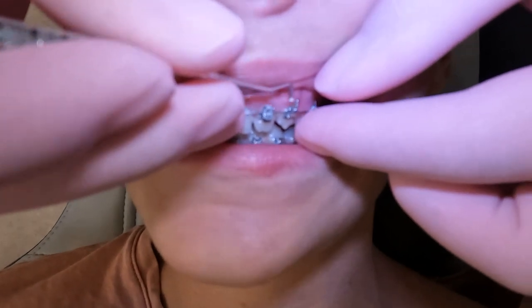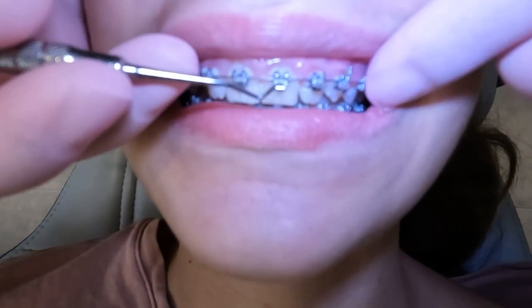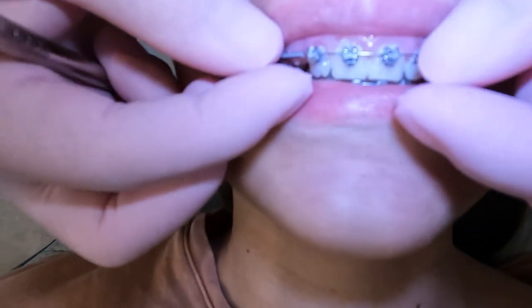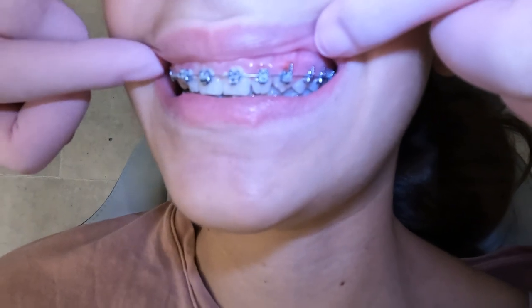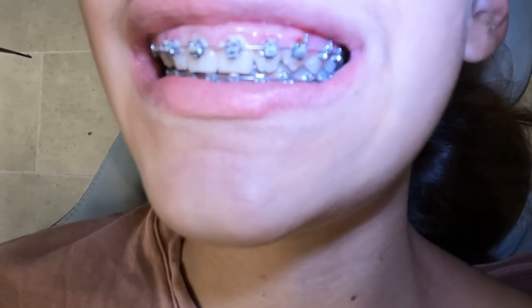Pop, pop, and you go all the way around and do all the brackets. You can see how that clip helps hold the wire in. Then let's go ahead and move that wire — you can move it up and down, it kind of comes out of place. Once all the doors are open, you can take out the wire completely and change the wire, make your normal adjustments.